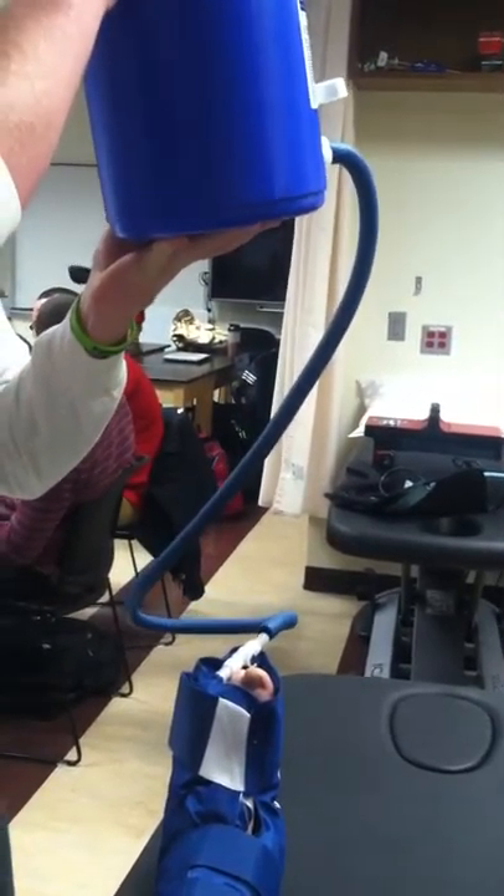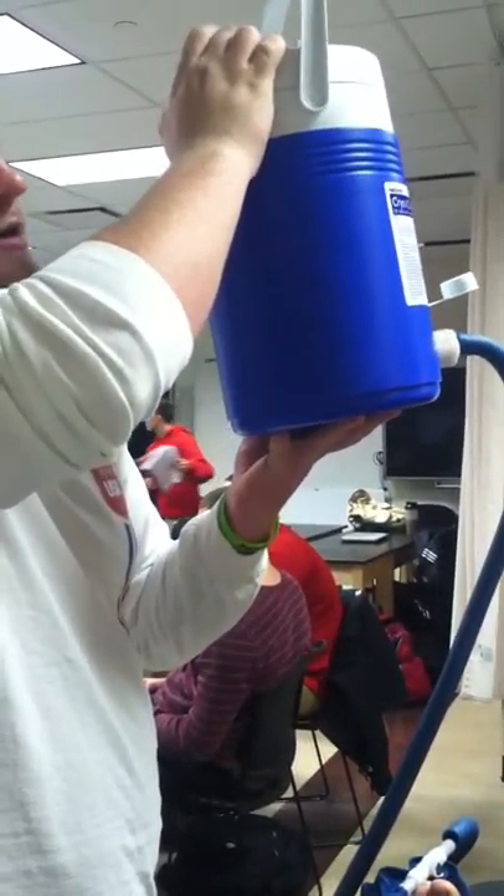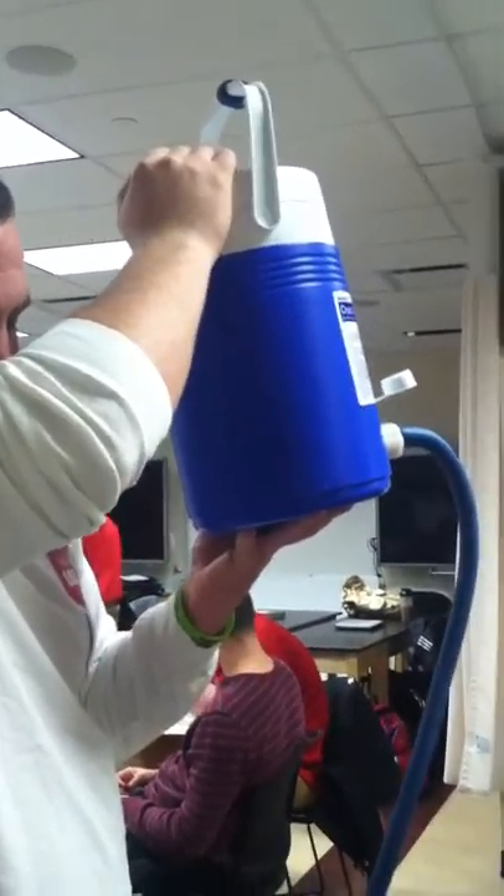Throughout the treatment, you're going to want to close this, drain the water back out, put water in, shake it again, then open the cap and put it back in so they don't get used to the temperature.